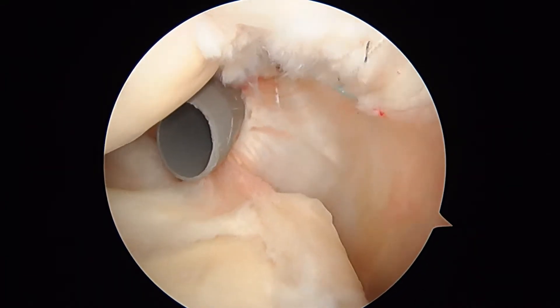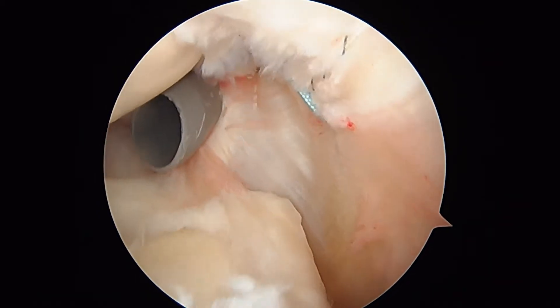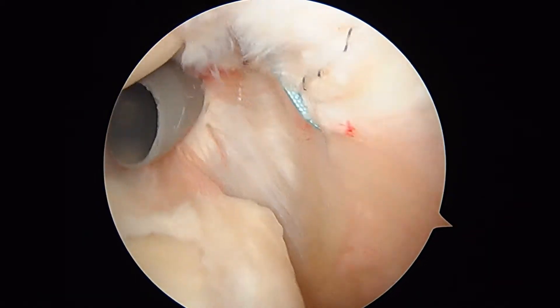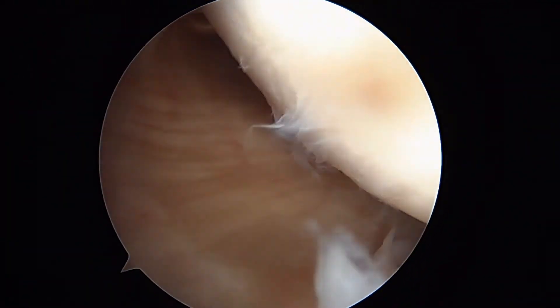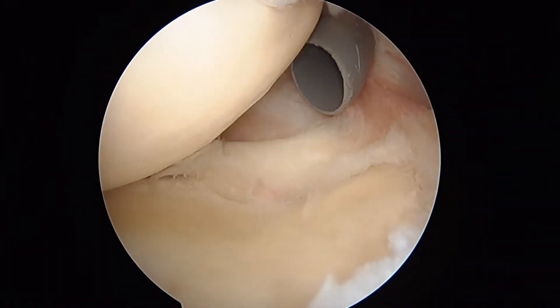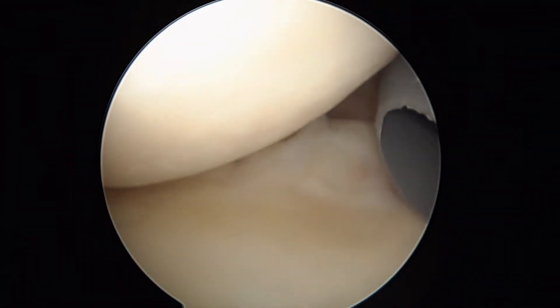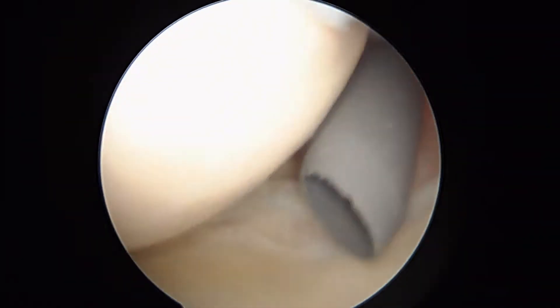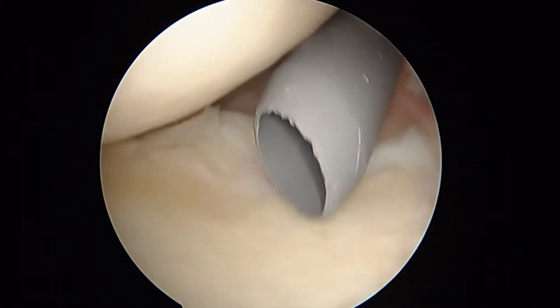You can see how we've got a cross stitch to help hold this cuff. Now we're going to stop inside the joint and get to work in the subacromial space. We can see there's not much arthritis — the rest of the joint actually looks pretty good, no significant fraying, no signs of any other significant instability. The next thing we show you on the video will be in the subacromial space.